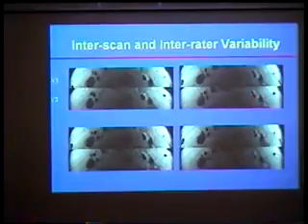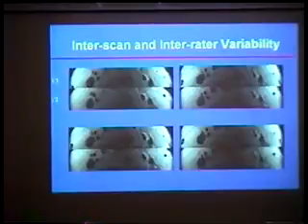This really is a very nice example of the so-called expansive remodeling. There the lesion grows outwards first in an artery rather than growing inwards. So keep that in mind. If you remember anything from the seminar, it is that stenosis doesn't tell you that information at all. So an accurate measurement of stenosis can only give you very limited information about where the lesion is and what lesion poses real threat to patients.